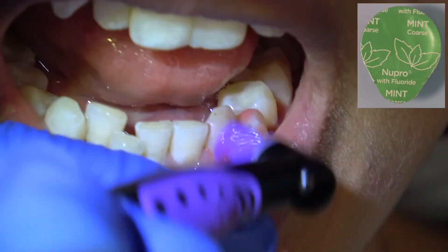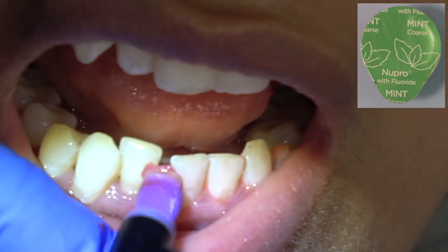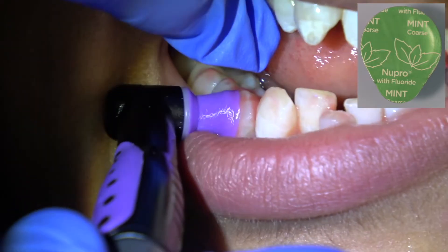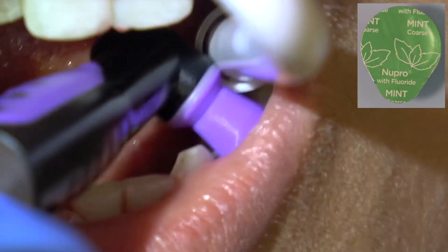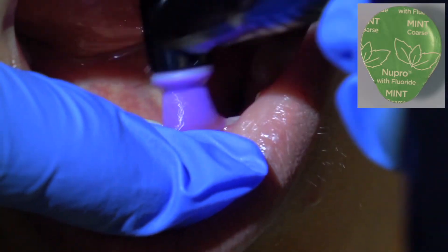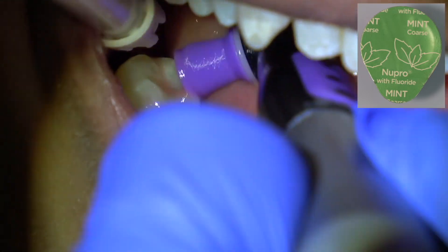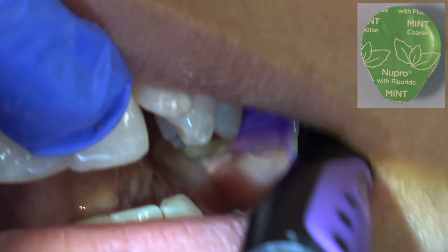You can rinse with mouthwash all you want, but that rotting food is going to be between your teeth — so floss your teeth correctly and watch the video on how to brush and floss. Now she's polishing: we put a drop of hydrogen peroxide or tooth bleach in the polishing paste, which just lightens the teeth up a little bit. You can see how much better they look and how much healthier the gums are.